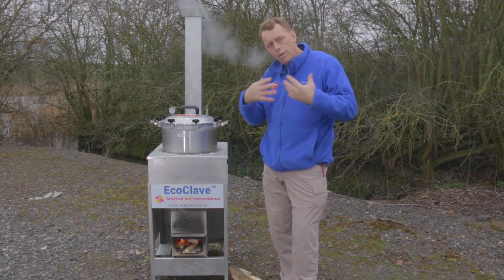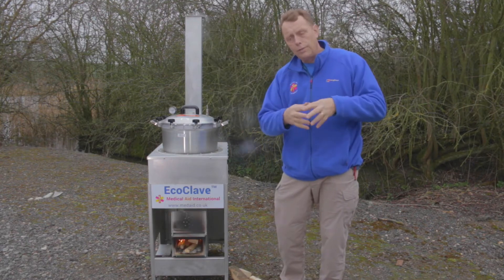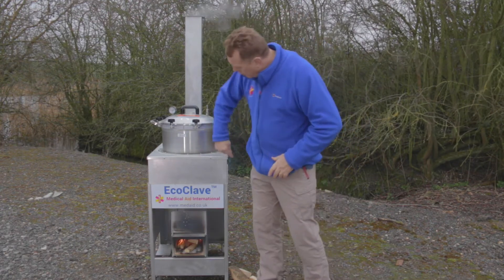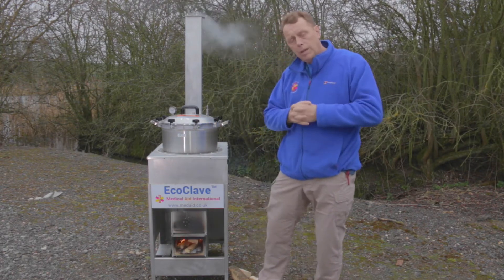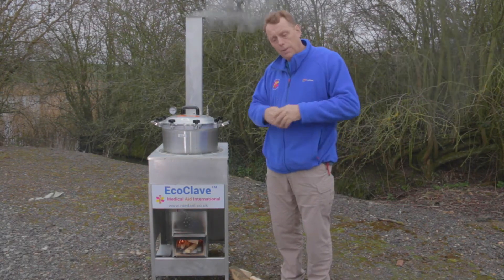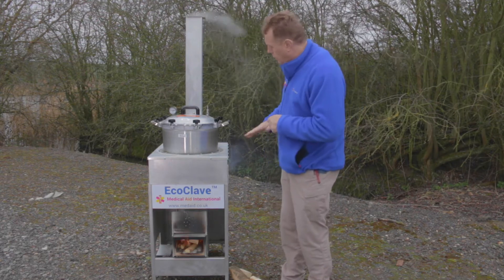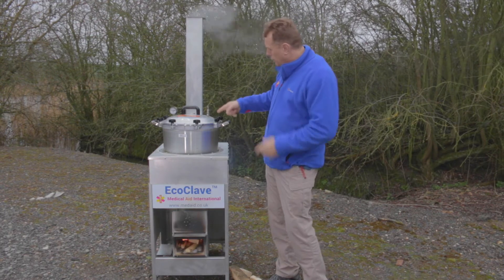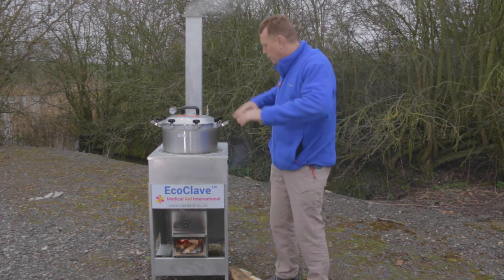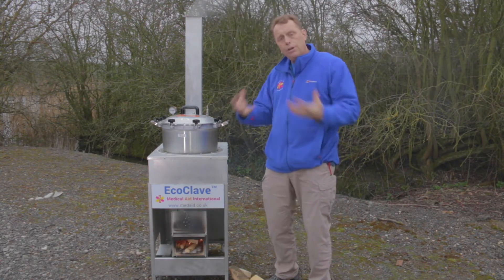One key thing to remember is that the standard pressure cooker autoclave we find in the developing world only has about an inch of water in the bottom. Therefore the heat going all the way around is used very efficiently, meaning the water is heated very quickly. Pressure cooker autoclaves operate through high pressure steam killing all the bacteria and microbes on the instrumentation. The water boils inside the autoclave and sends out steam. When we have continuous steam coming out, that means the inside is full of steam and there is no air.